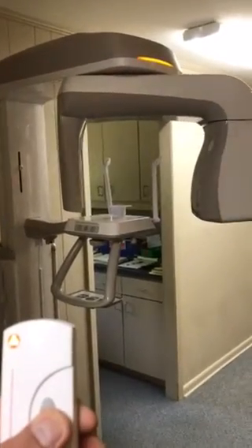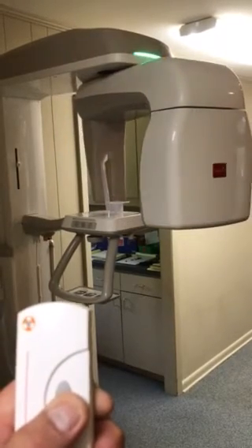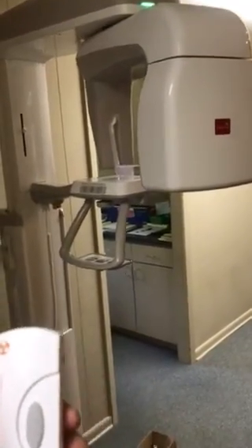Please close your eyes. The screen will turn blue and it will tell you to hold down the exposure button. So you take the exposure switch that's on the wall here and you back out of the way and you press the button and it's going to start taking an x-ray. You'll notice the light up top turn from green to orange. That lets you know that it is radiating. Image capturing is complete. Okay, image is complete.